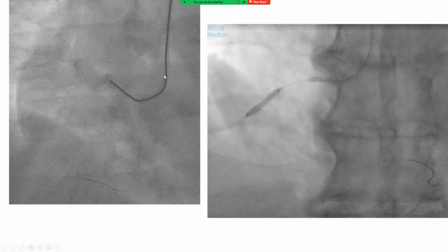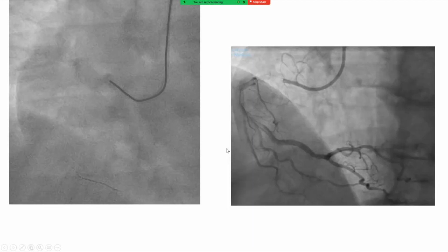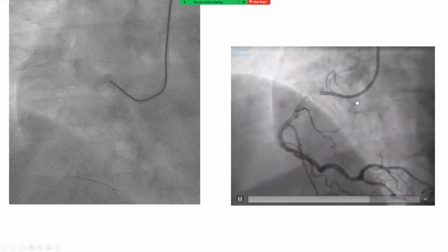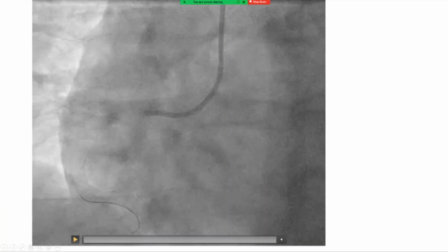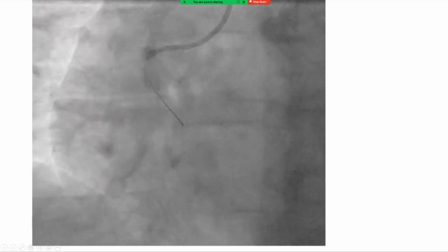This is another case. We start off with a coaxial duck shape. Then we pulled it for deeper engagement and for more predictability with pull and push. And we did all of our maneuvers with push and pull in this position, the deep elongated coaxial guide. See how it is deep and elongated here in the coronary, but it's not duck-shaped on the aortic valve. And at the end, to disengage it, because it's elongated and not duck-shaped, we just pulled it out.